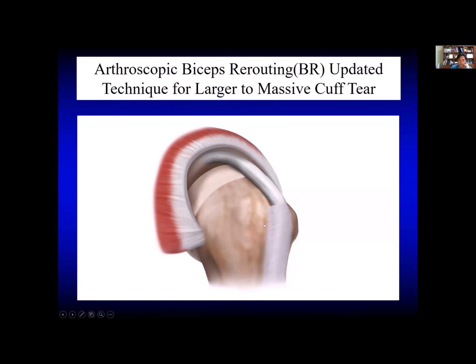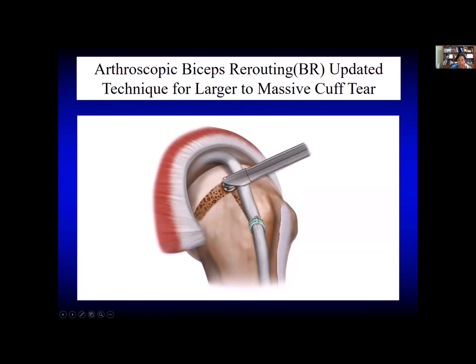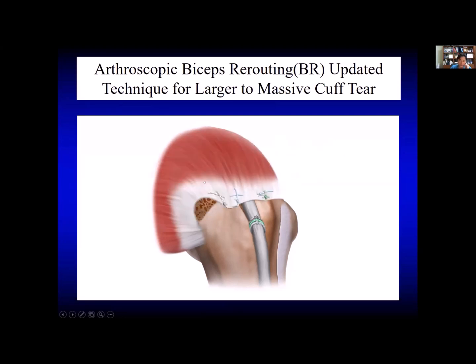This is a schematic drawing. After releasing the soft tissue around the biceps groove, make a new groove in the biceps footprint, and insert a lateral anchor for biceps rerouting like this, and then medialize with the motorized burr about 1 cm. Then instead of inserting one anchor, I insert two anchors, one anterior and one posterior to the biceps, and then repair. I do not repair the biceps itself, just the cuff, making a kind of boundary to restrict the biceps so it cannot move anteriorly or posteriorly. So fix the biceps on the lateral side and do not tie the middle row. This is modified to reduce the overtension in the medial side.